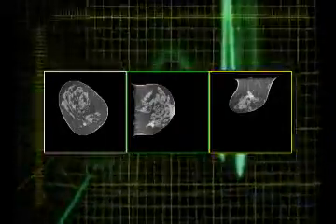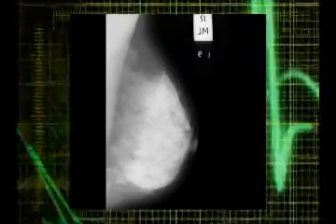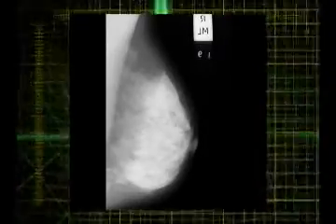Actually, we develop them, and as a mammography tech, I make sure I have all the breast tissue, that I have no wrinkles, no folds, no motion. And then we leave the rest of the work up to the radiologist. So is that why you have to hold your breath when this is going on? Absolutely. If you breathe or move, it's going to cause a little bit of motion. So we always make sure we check for that. So is this actually just an X-ray machine then? It is an X-ray machine, yes.